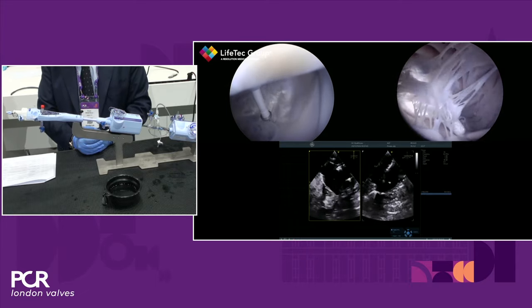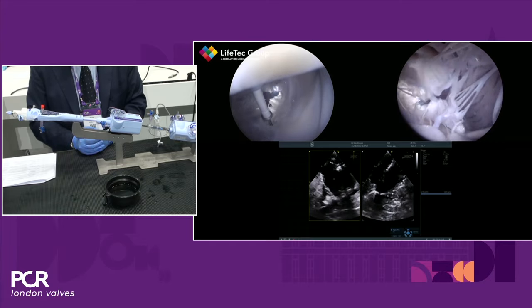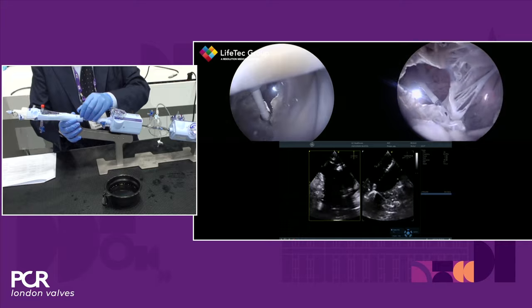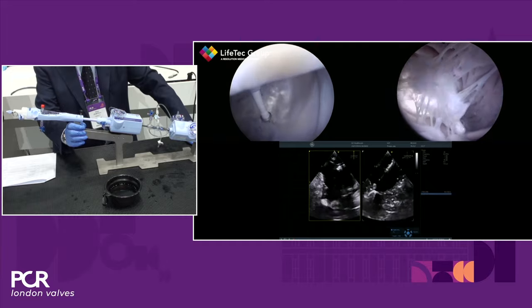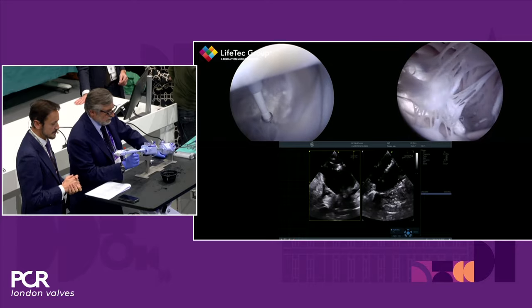so are you happy with this or you want to reposition? I think this clip looks in a good position. That means that we are more or less in the chordal free zone of the tricuspid anteroseptal portion, which is not too close to the commissure, not too close to the center. It seems that the symmetry of the leaflet is respected, so we are perpendicular to the line of coaptation.